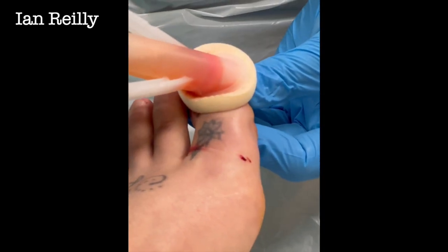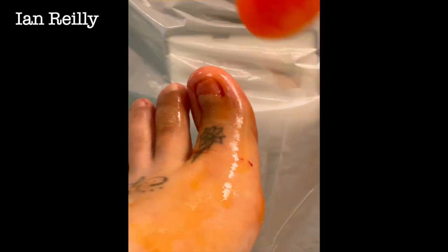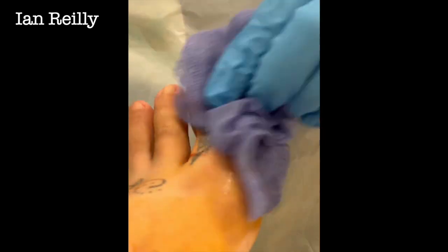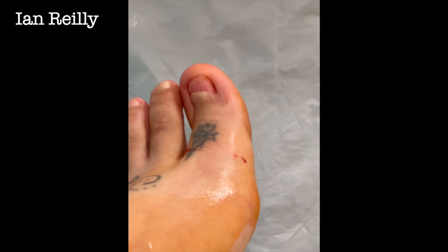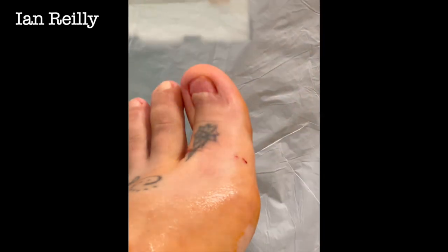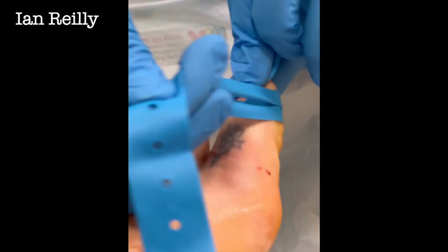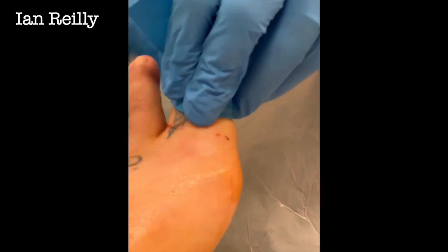We're going to do a little Winograd spiculectomy. You join us halfway through — we've already done a little bit of local anesthetic. We're going to use our 15 blade for this and basically do what effectively is a Winograd spiculectomy. Not sure it's really got a name, this procedure, but that's probably about the nearest we can call it. We'll start off with a little tourniquet — local anesthetic is in, I put four mils in, two mils per toe.